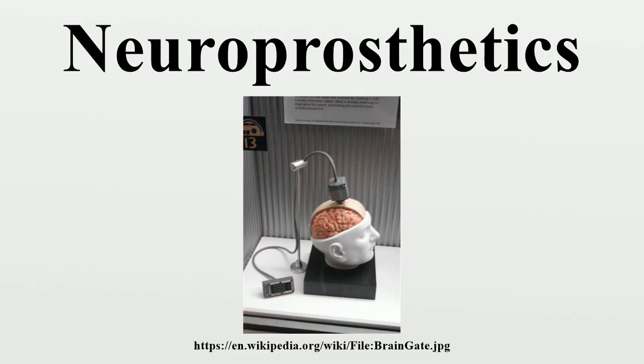The requirements for a high-resolution retinal prosthesis should follow from the needs and desires of blind individuals who will benefit from the device. Interactions with these patients indicate that mobility without a cane, face recognition and reading are the main necessary enabling capabilities. The results and implications of fully functional visual prostheses are exciting. However, the challenges are grave.